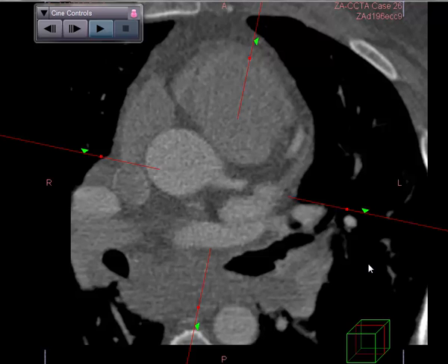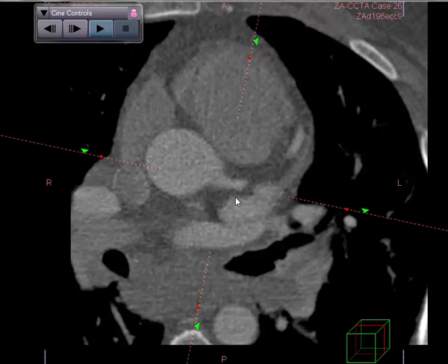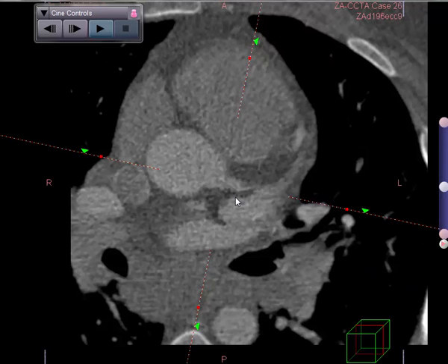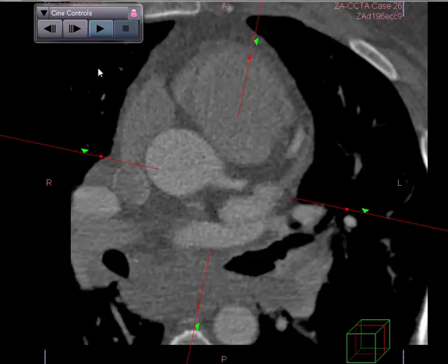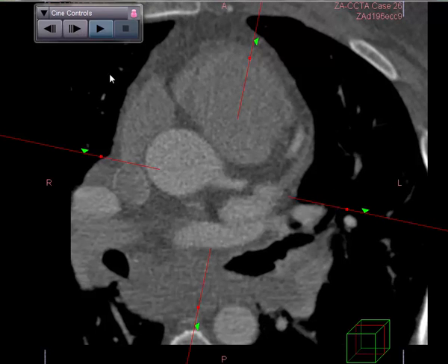Let's first look at his coronary arteries. The image quality is not superior — these are somewhat fuzzy images. There are two phases which can be switched back and forth using the CINE controls.